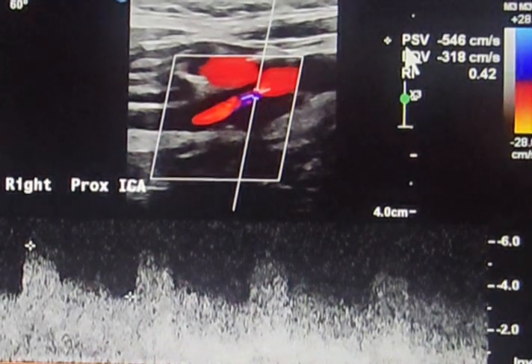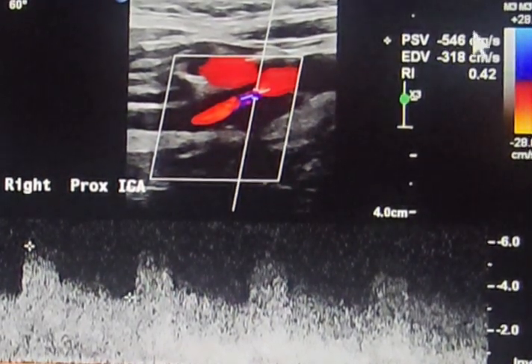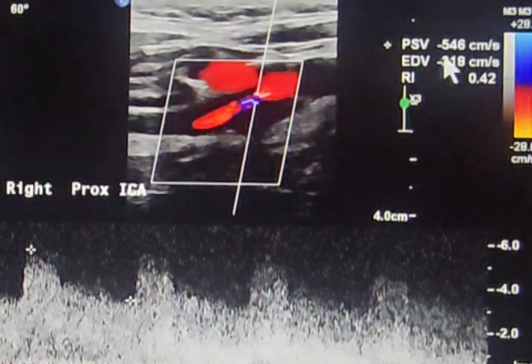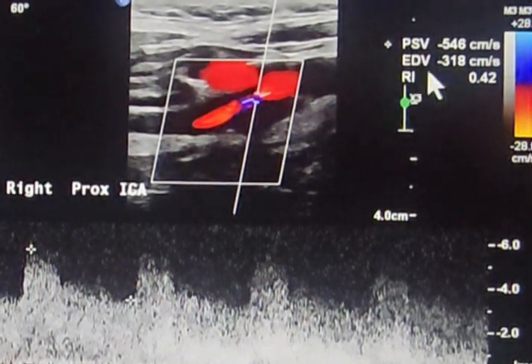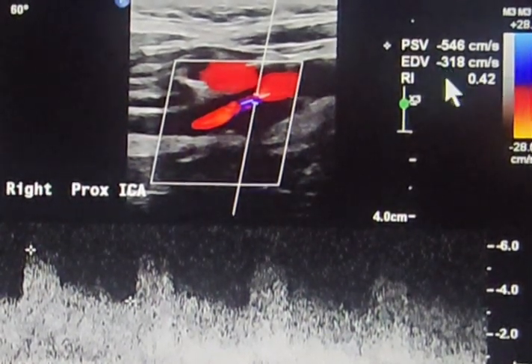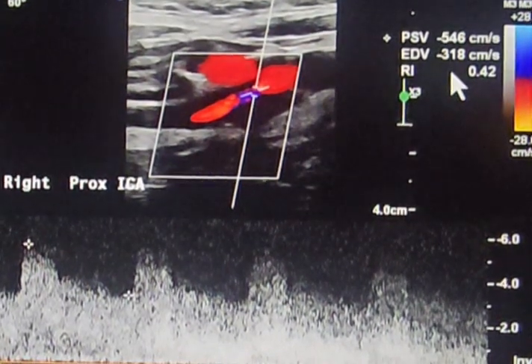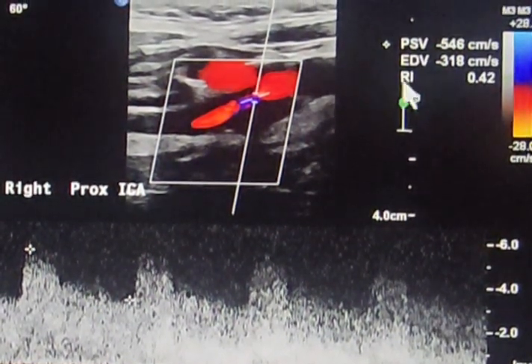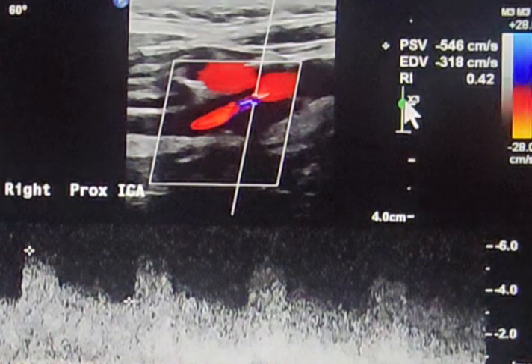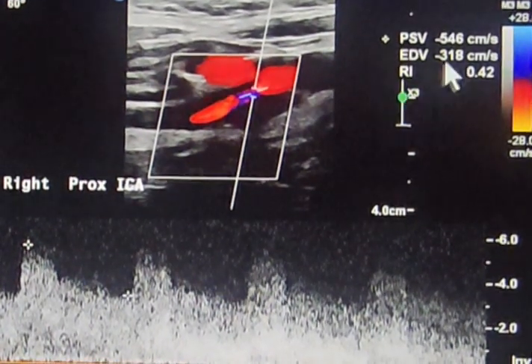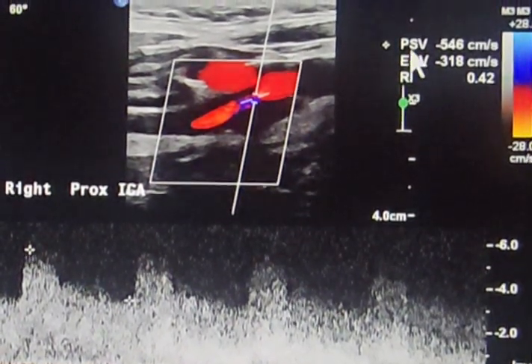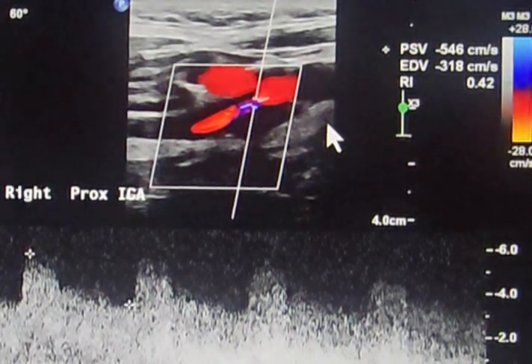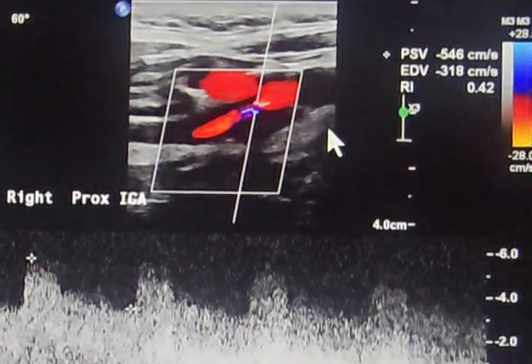Here we have the peak systolic velocity extremely high — it was 546 cm/s. Whenever the peak systolic velocity is greater than 230 and the end diastolic velocity is greater than 100, it means that the stenosis lies between 70 to 99 percent.